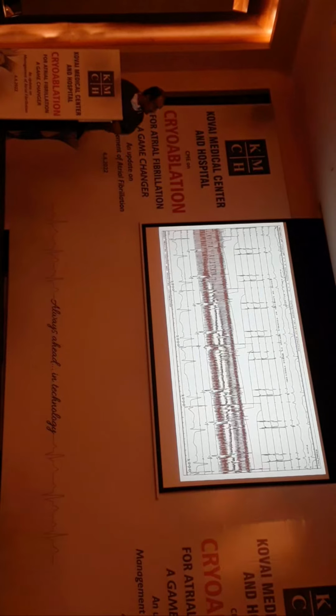So this is again a right superior pulmonary vein. You can see huge pulmonary vein potentials here again. So again we pace here. You can see we are pacing the diaphragm here and we are isolating. So there's a complete isolation here. You can see there is no signal recorded in the pulmonary veins.